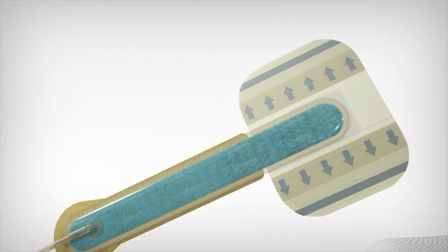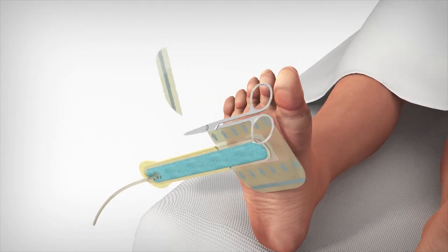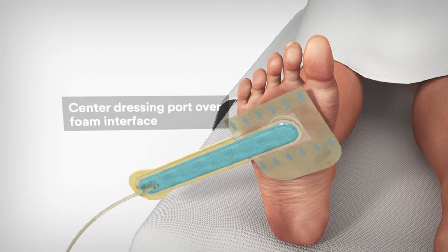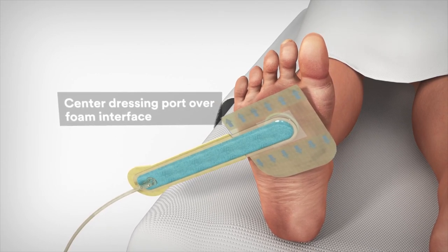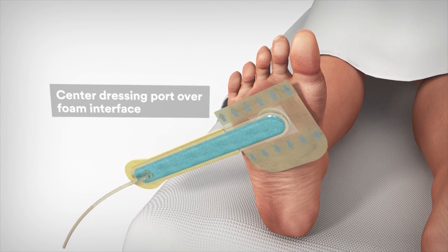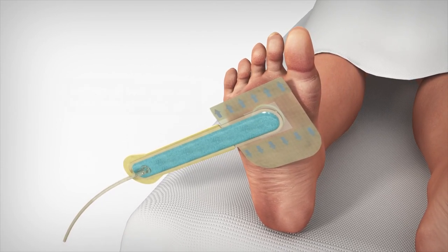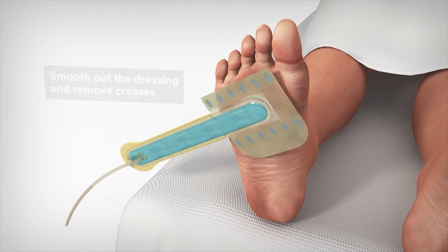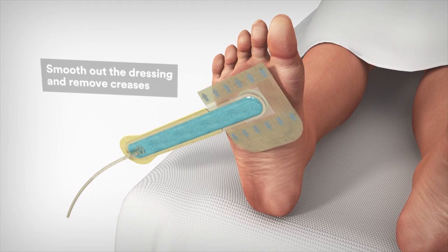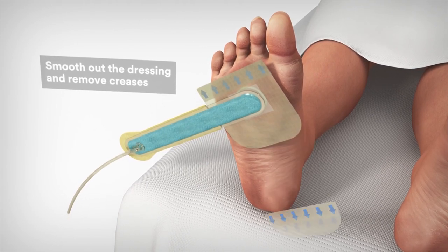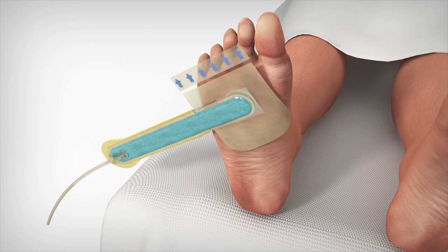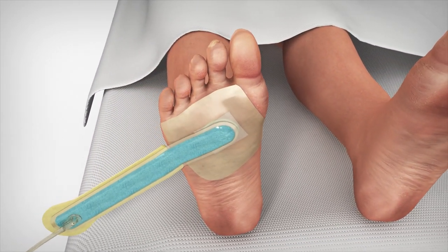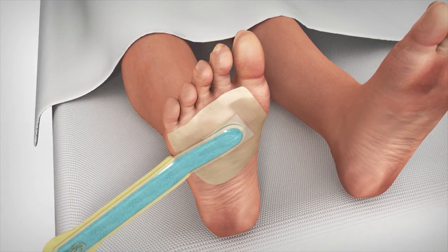To begin application of the SNAP bridge dressing, slowly peel away the release liner as you carefully place the SNAP bridge dressing over the wound. Ensure the center opening of the port is placed directly over the foam interface and carefully apply the dressing over the wound. The dressing should be adhered to at least 1 cm of intact skin to maintain a proper seal. Smooth out the hydrocolloid dressing onto the skin and remove any small creases. Use your hands to smooth out the dressing to ensure an airtight seal to the skin.